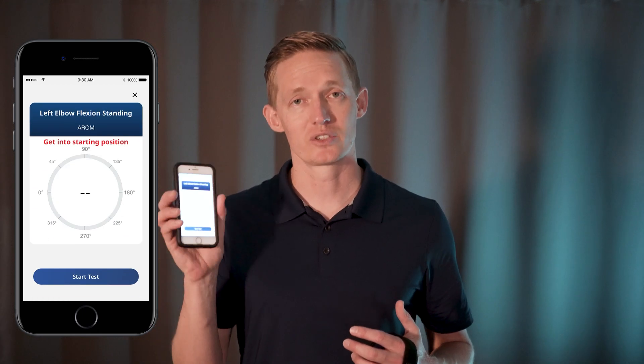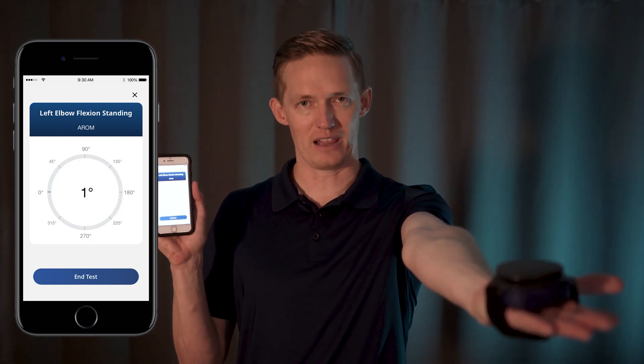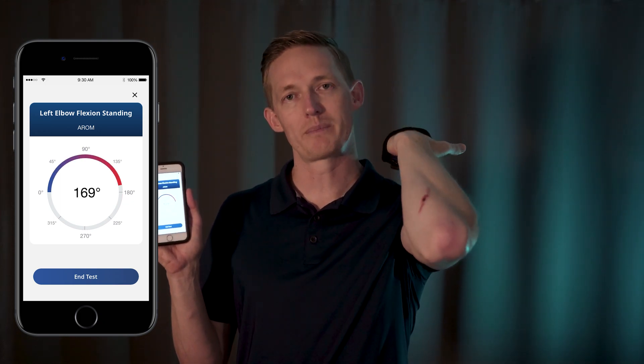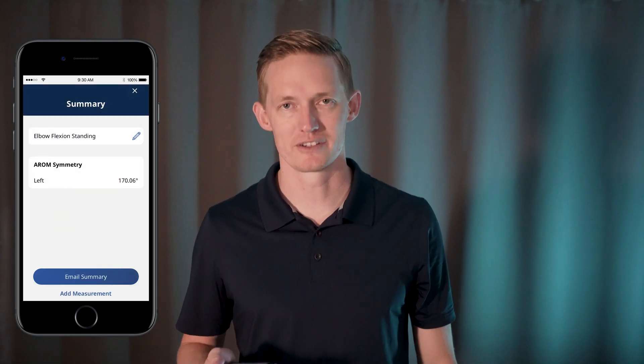After you finish naming your test, you'll see a calibration screen where you want to get into your starting position. Once you're ready to perform the test, go ahead and press start, wait for calibration to finish, and move the joint you wish to test in one plane of motion until it reaches its max range. End test and you can view summary, email the data to yourself, or perform another test.